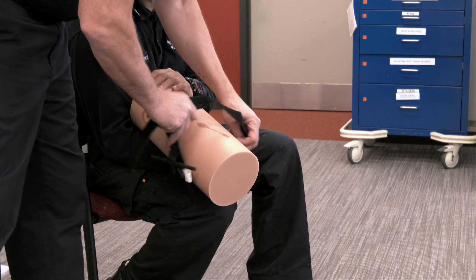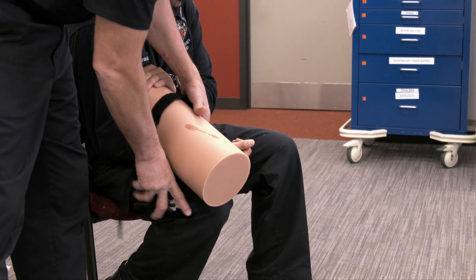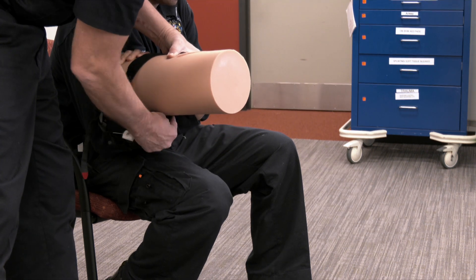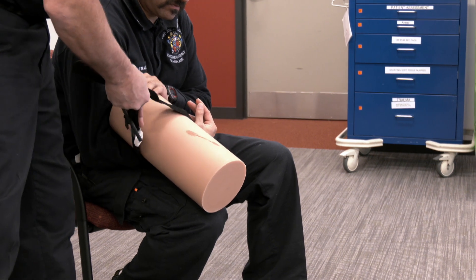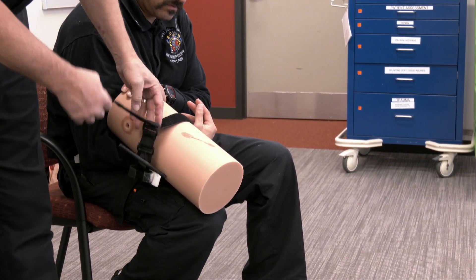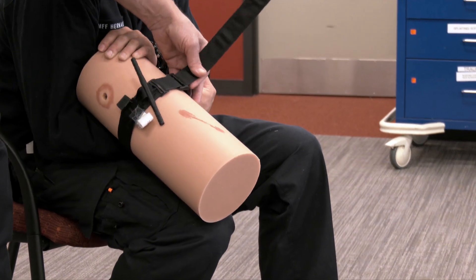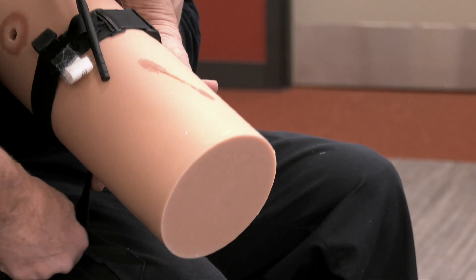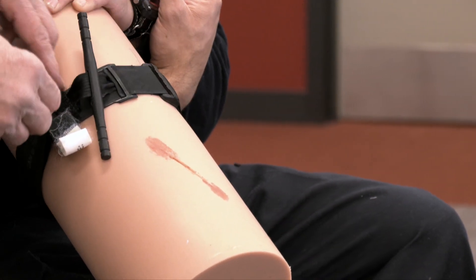When we take this thing we're going to put it on — once again we want to go high and tight. The thought process behind high and tight is that it will allow us to squeeze everything in there against the long bone. Make sure you're going through the buckle here, because these come through and they're not always hooked up to the buckle. Get that nice and snug all the way through, and get as much velcro coverage as you possibly can.